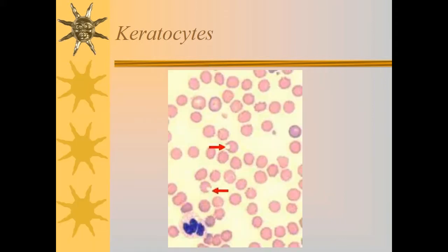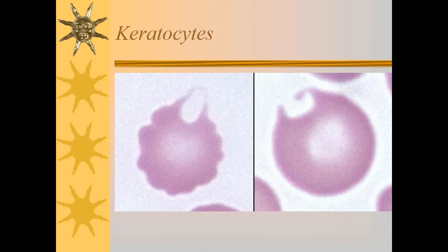Keratocytes are often formed when fibrin strands are precipitating out, as might occur when an animal becomes hypercoagulable. Picture an array of fine fibrin strands that an RBC is rushing towards. When it hits a fibrin strand, the edge of the cell gets sheared off, creating this appearance. A couple keratocytes, seen up close.